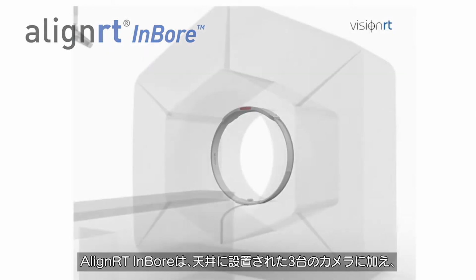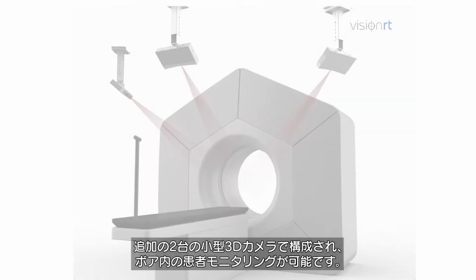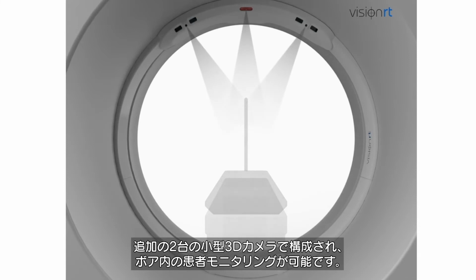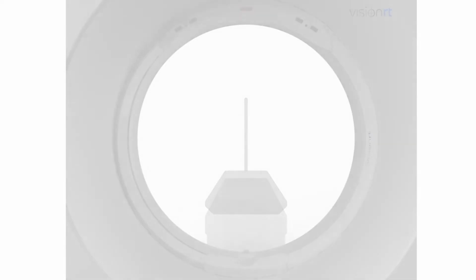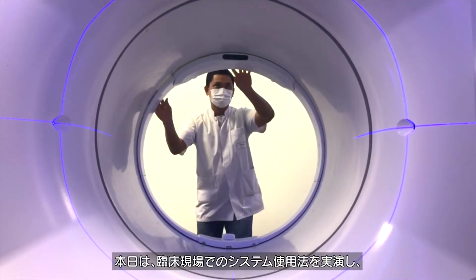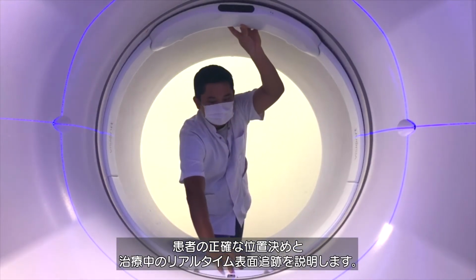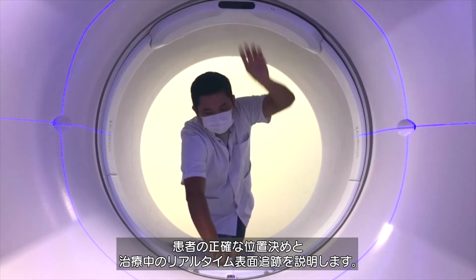AlignRT Inbore consists of 3 ceiling-mounted cameras, plus an additional 2 miniaturized 3D cameras, allowing the monitoring of patients inside the bore. Today we will demonstrate how the system is used in a clinical setting to enable accurate patient positioning and real-time surface tracking throughout the patient's treatment session.